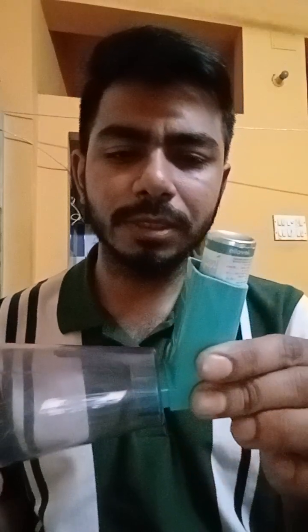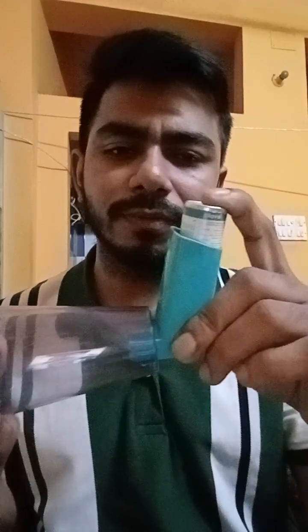So the inhaler should always be used with the spacer. This is something called a spacer. Let me tell you about it. This spacer has the inhalational chamber, this is the lock, this is the mouthpiece cap, and if you remove the cap, this portion is the mouthpiece. So this is the spacer, and usually these inhalers should be taken with spacers, right? We'll fix the inhaler in the spacer like that, and then we shall deliver it.